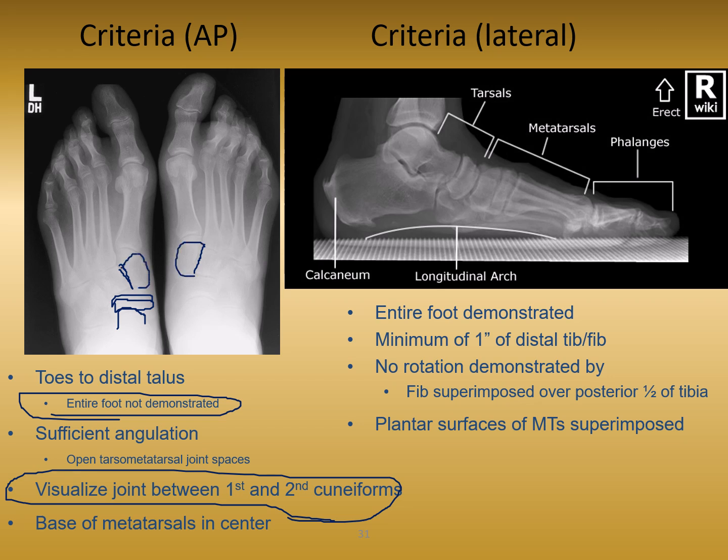without rotation. That's something that would show us if they were rotating their foot, kind of like rolling out on the lateral side of their foot, or maybe their knees, maybe this person naturally is either bow-legged or their knees go inward. I'm sure you know what I mean when I talk about how some people's knees will naturally go outward more and some people's knees will go inward more. Those are things that you're going to be recognizing on your patient as you're doing their x-rays. And you'll know that it's not an error on the image, but it's just the way that they naturally are.